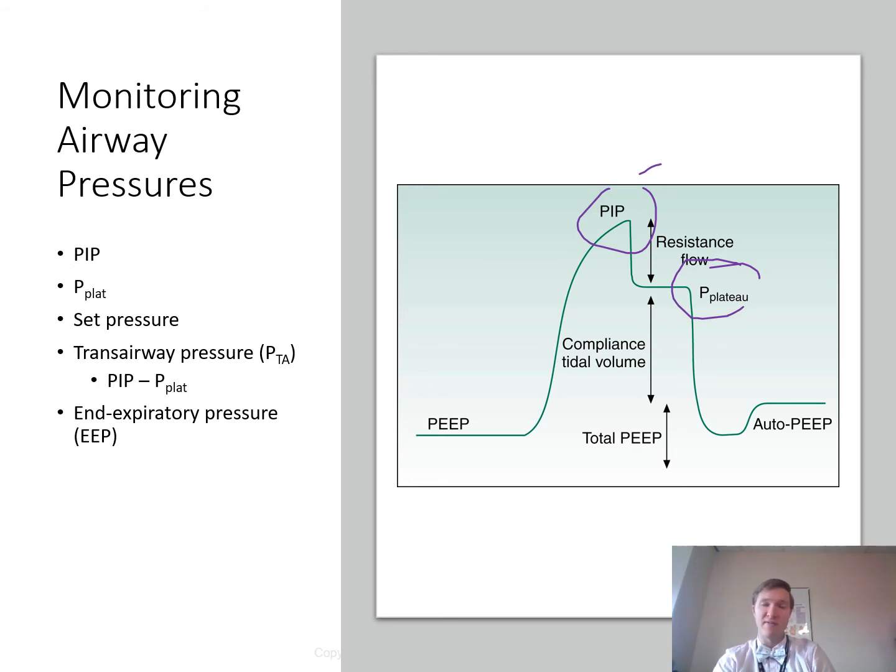And in fact, in neonate volume ventilation, that's where we also look, having that sensor proximal to the baby, which gives us the most accurate reading, because then we don't have to worry about the expiratory line having enough flow through it to make sure we're reading accurate pressures and volumes. Proximal pressures are usually obtained by connecting a monitor tubing or plastic Y connector to the circuit. But like I said, some ventilators like the Hamiltons I know will have the proximal sensors. Others might have that adapter ability as well. What you're doing here is trying to look at the circuit pressure before it goes through the circuit.